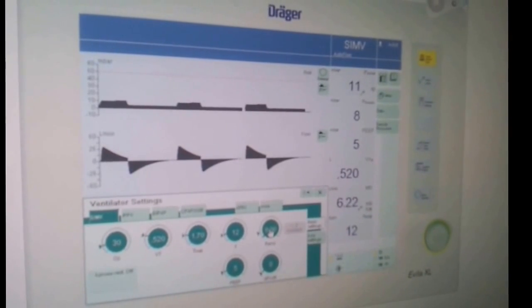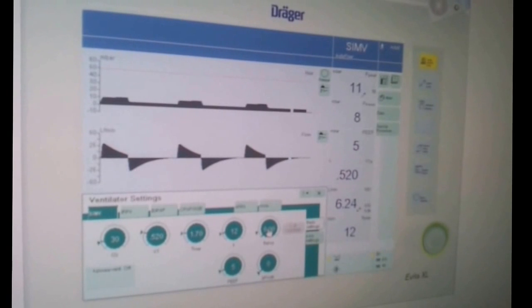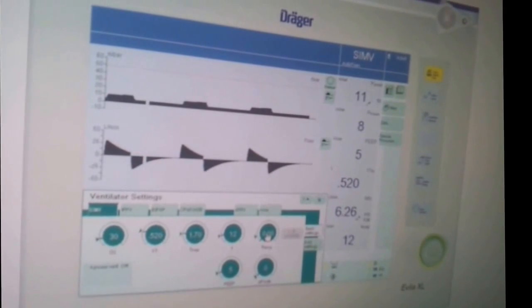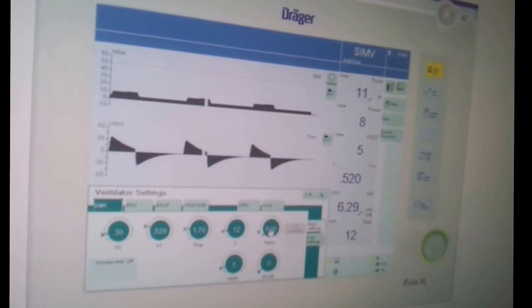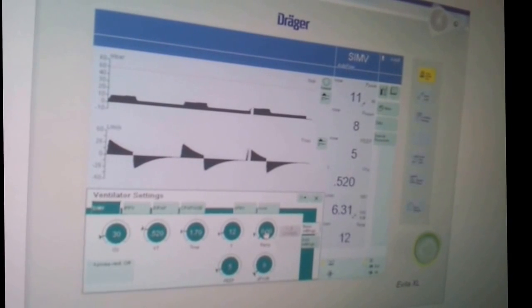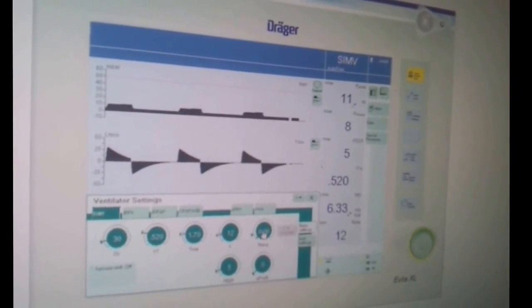So it's not to do with passive inspiration or expiration? No, it's to do with the machine determining how the air flows. How the air flows. Okay. So inspiration will always be mechanical in a patient who is paralyzed, and expiration would always be passive in a ventilated patient.